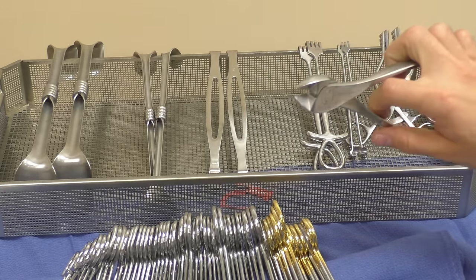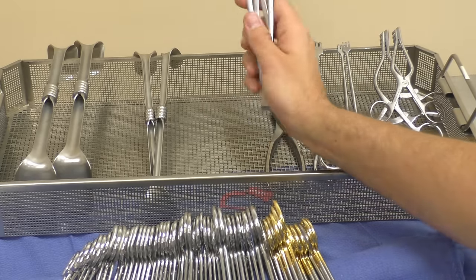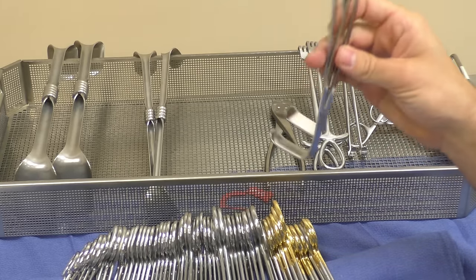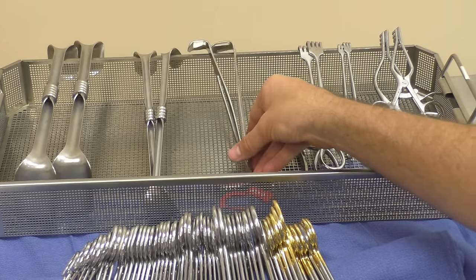A pin cutter. Also, you will see a lot in breast surgery, like a needle localization, stuff like that. U.S. Army Navy's, also known as just the Army Navy retractor. Good general use item. You'll see that used quite often in multitude of general cases.